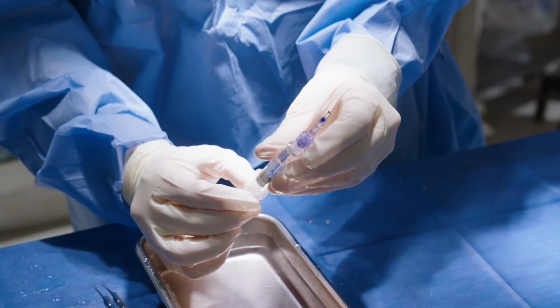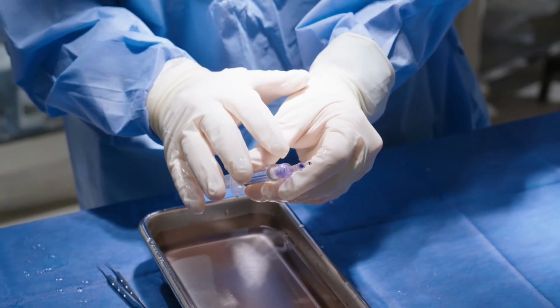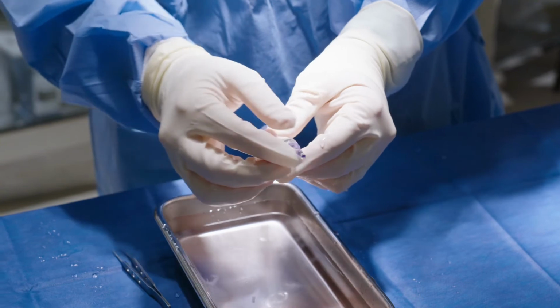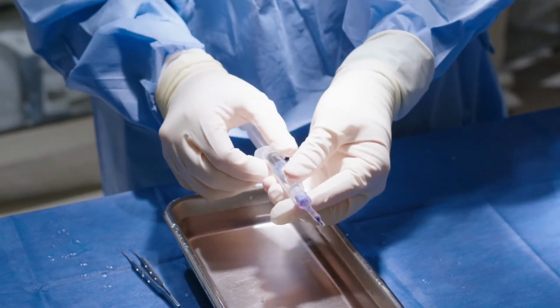There we go. So this tissue is a lot more forgiving for that than the DMEK tissue. You don't have to worry about the graft expelling out unless you use a lot of force. So we're ready to use this tissue now.